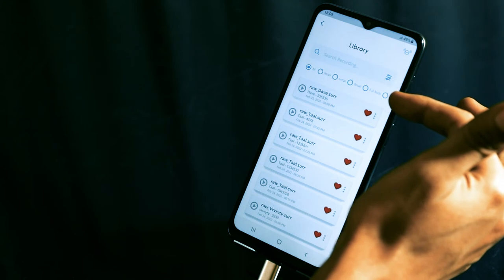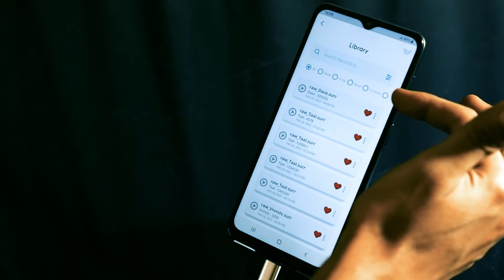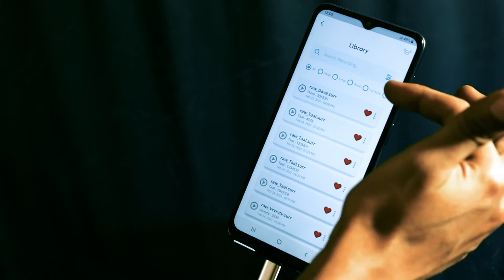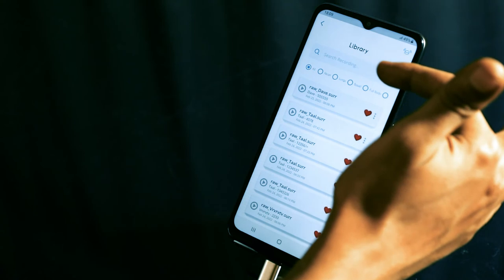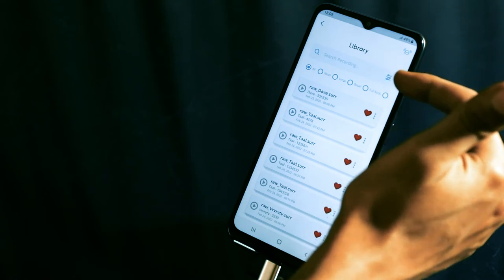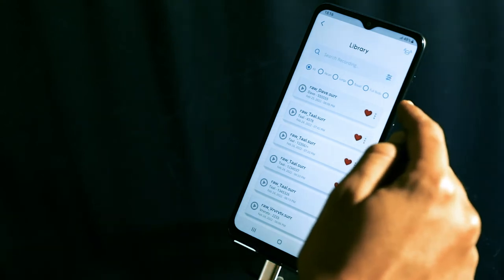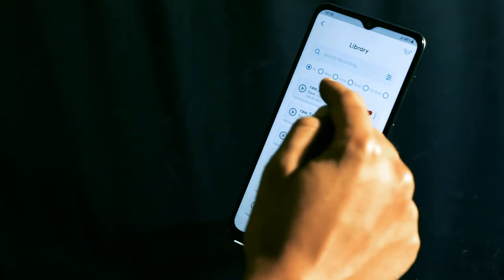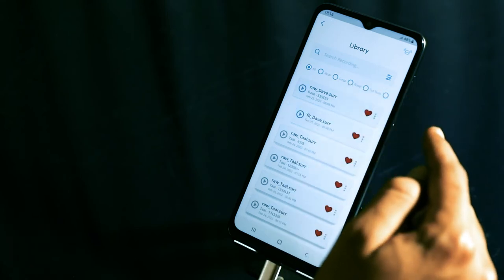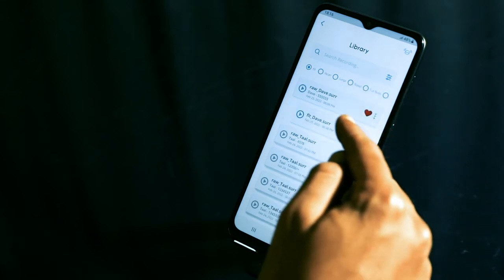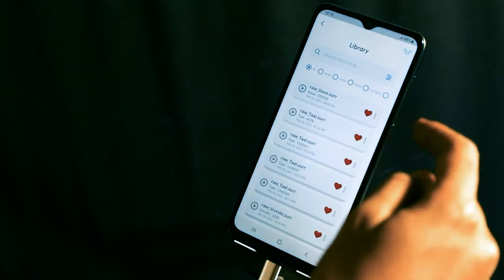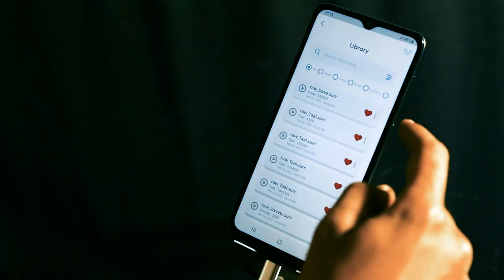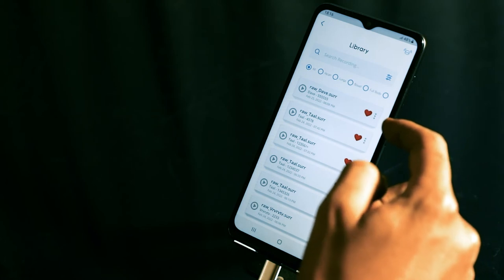This filter allows you to sort through files by a filtration type, like heart filter, lung filter, or bowel filter. The best part about the Tal app is that it records the raw sound as well as the filtered sound. No matter how much editing you do, the raw sound will always be preserved for later use.